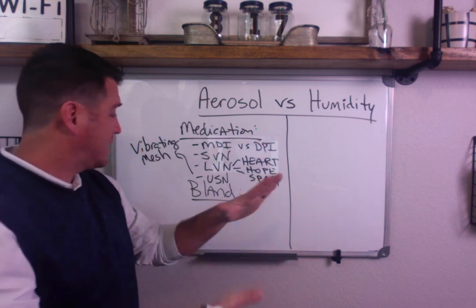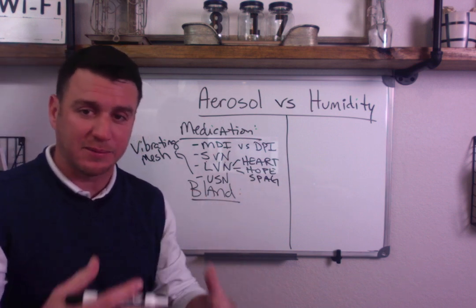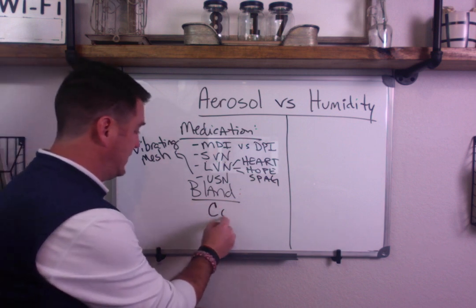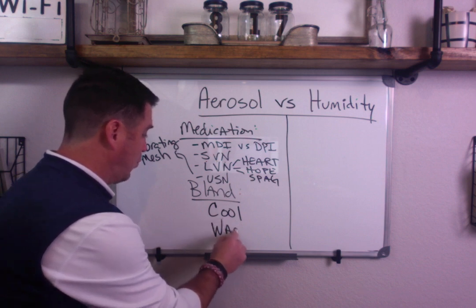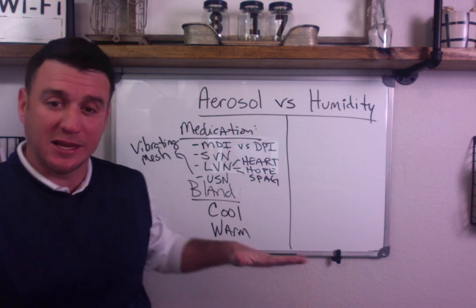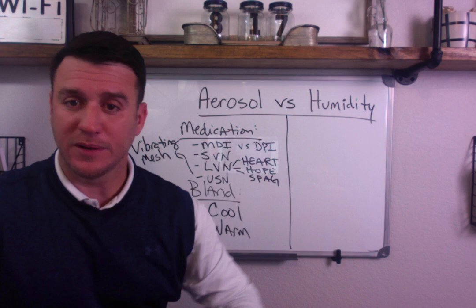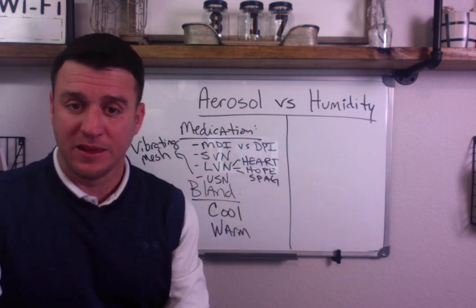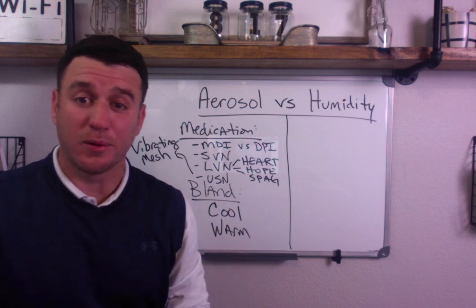Now, when it comes to bland aerosol, what you typically need to know, and again, I could go deeper into this, but I'm just going to keep it surface level. We're talking about bland aerosol. The question is, do we deliver cool mist or do we need to warm it or provide heated aerosol? So when I say warm, I'm saying heated aerosol. When I say cool, I'm saying a large volume nebulizer set up without any heater device attached. The answer to this question is anytime you're bypassing the upper airway.